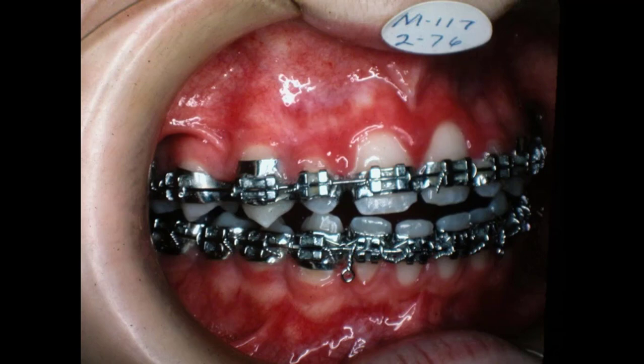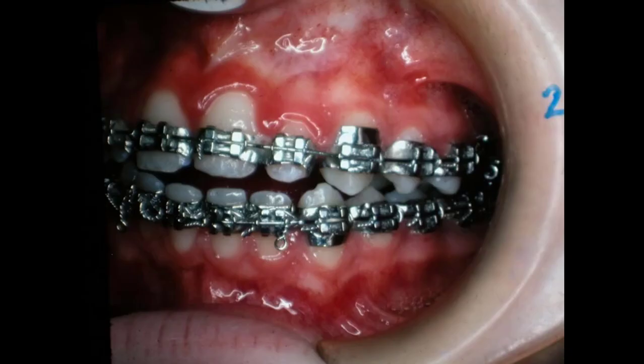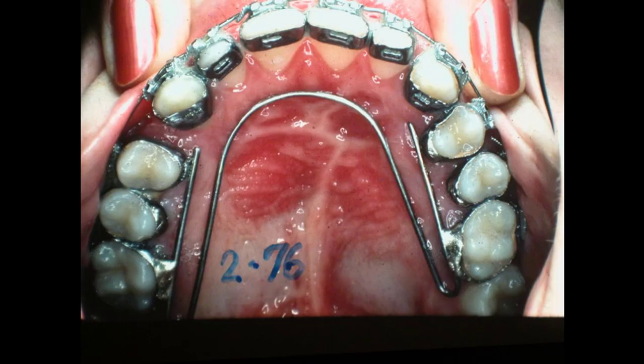So here we are in 1976 — now we've pulled this together, and we've been working on this for some time. We're going to come in and pull the thing together. And there — we put that lingual bar in place in 2 of 76.